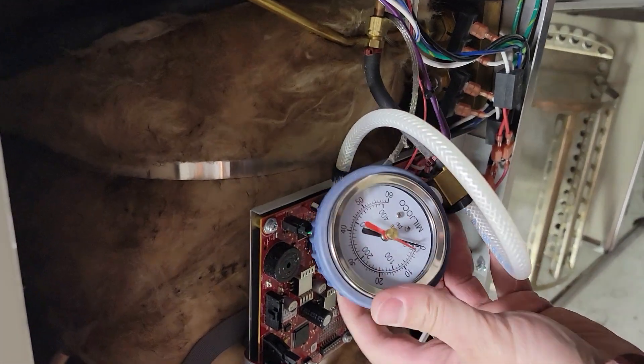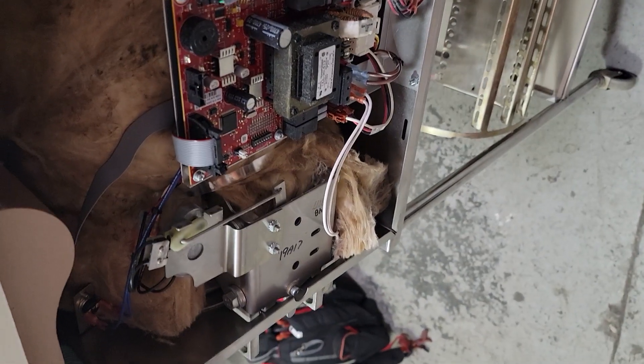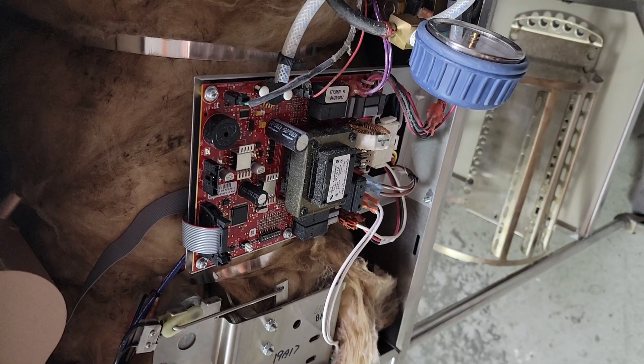Put your pressure gauge on, because there's no point in running a cycle without a pressure gauge to verify. Otherwise you'd run it, find the error, and then later have to go back and check pressure. You can skip a step by combining them this way — makes it quicker and easier.